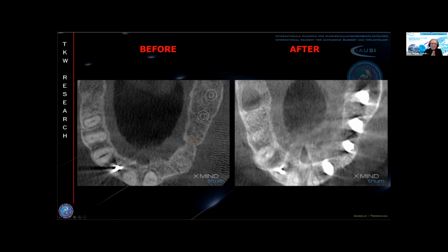But as I tell my students and my postdocs in basic implantology, first you have to learn to insert implants with eye-guided surgery. That means you have to have the orientation helped by the planning on 3D CBCT imaging. You imagine where you have to insert the implant, and then just by your eyes and by your mind, you have to transfer this knowledge and your planning with your hands to the site. Because it doesn't make sense to say, okay, implantology is just drilling holes. I just take a surgical guide and drill holes.